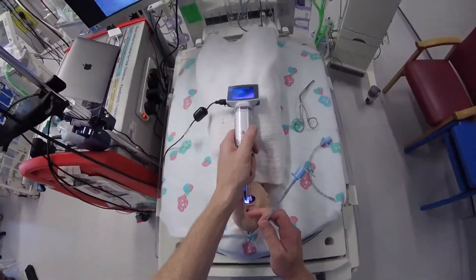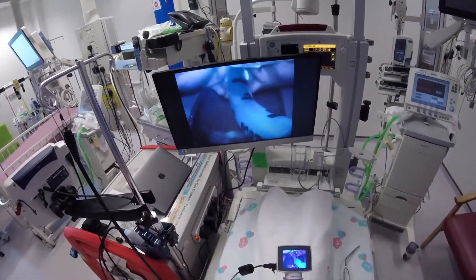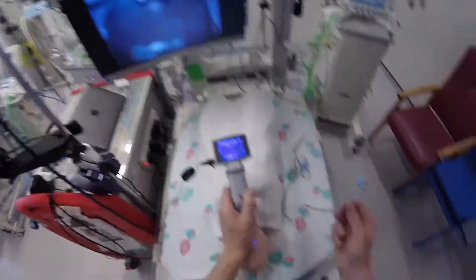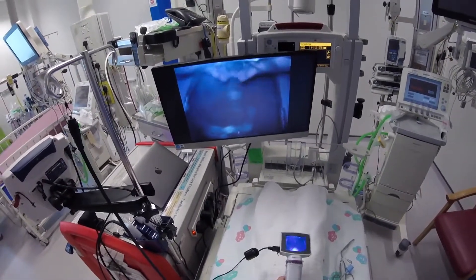We can also use this like a Miller blade — so if I go in and try to lift the epiglottis, and then drop the endotracheal tube in. Although they recommend you do use a stylet, it is still possible to use without a stylet if you don't have any difficulty doing the intubation.